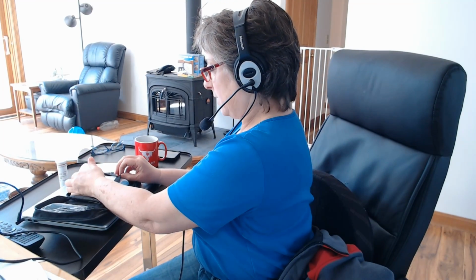And these strips are expensive because I get charged $1,000 a year for the privilege of renting this strippy thing. So, all right, my INR, it reads it out, it's 2.4, there we go. I will take the strip out, and then I call the company and report that it's 2.4, then the company faxes the information over. So that is price gouging at its biggest.